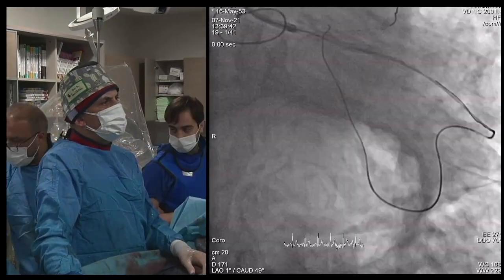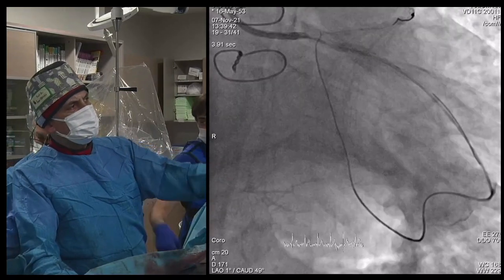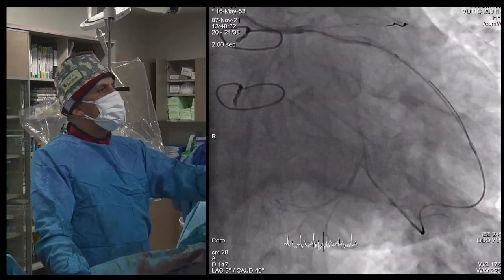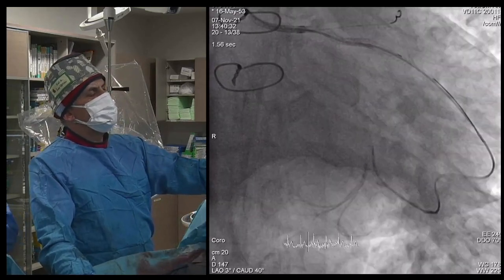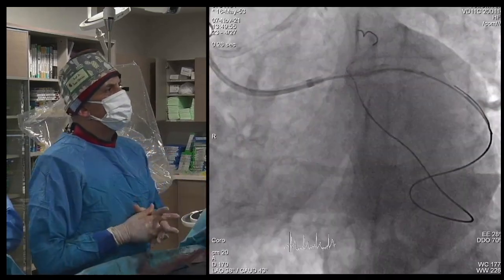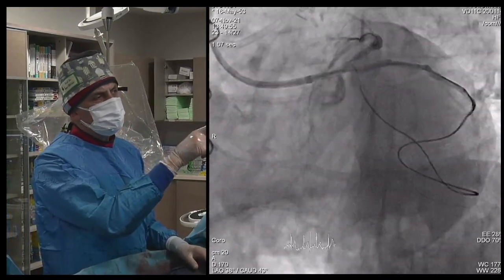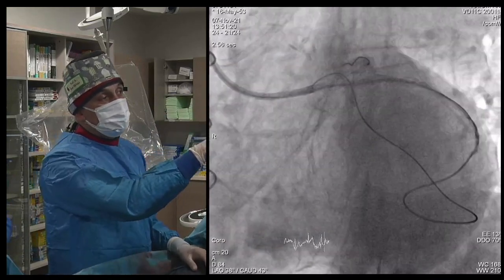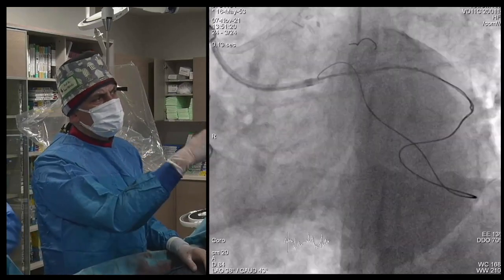We first chose Gaia Second, but it went subintimal. Then we tried Pilot 200, and it also went to the same subintimal place. So we failed retrograde at the base. This is subintimal — the wire is not in the lumen. This is under the intima at the left main. We had some retrograde dissection, but that's fine.